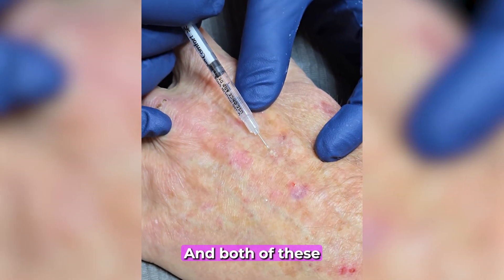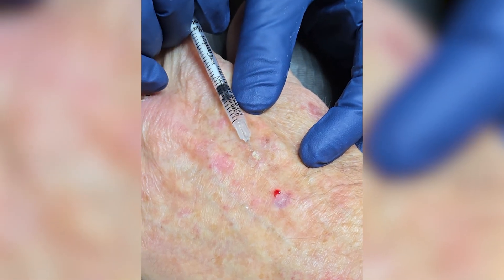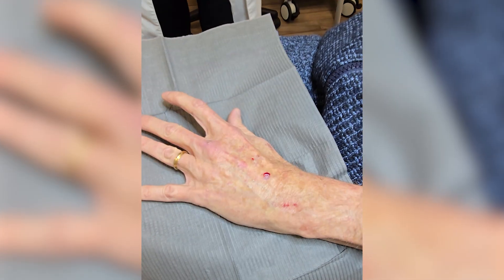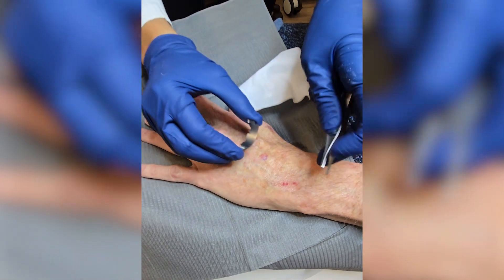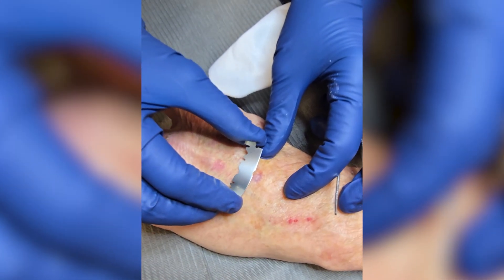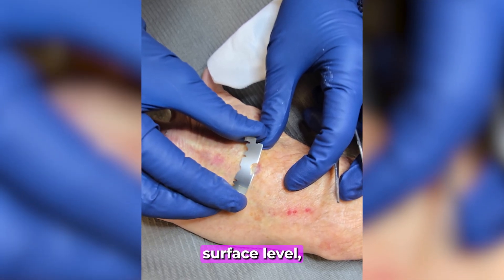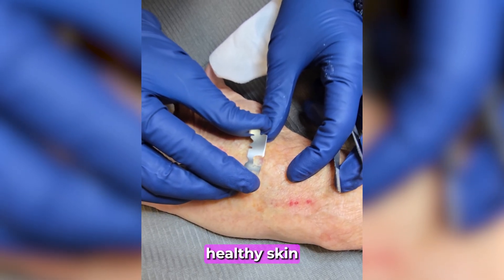And here is the second one as well — we'll send both of these away. The shave excision is performed using a sterile surgical blade. We carefully remove the raised, rough portion of the lesion just at the surface level without cutting deeply into the skin.